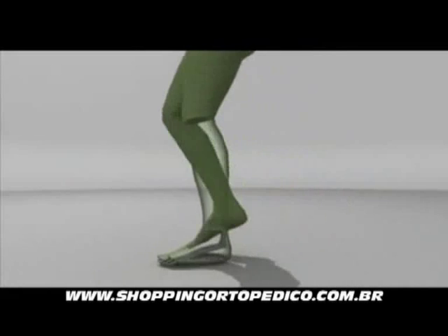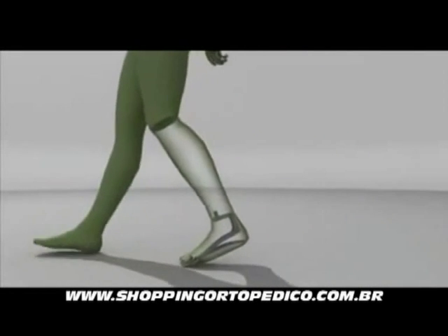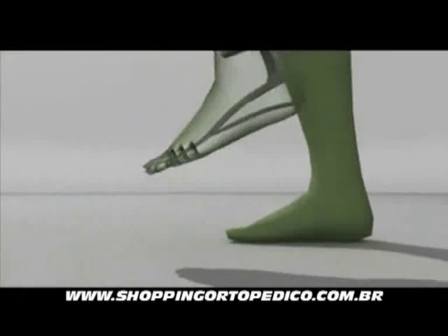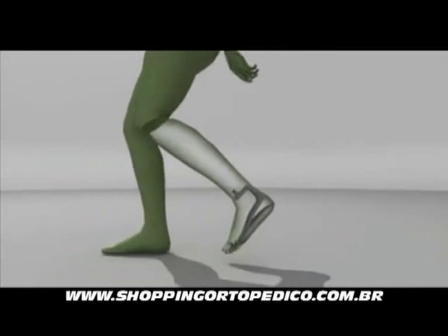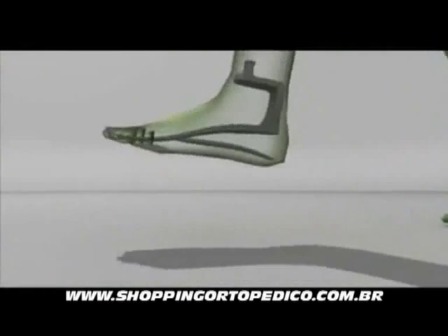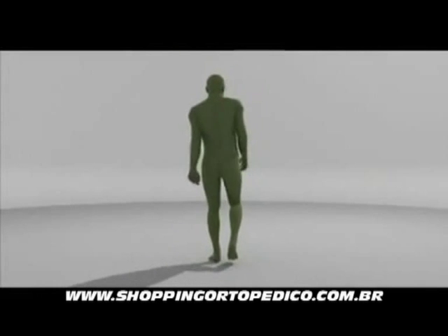In a conventional prosthetic foot, the angle of the ankle remains in a neutral position, with the result that during swing phase the toe effectively drags, unless the prosthesis is raised abnormally to clear the ground. This leads to additional call on remaining muscles and abnormal stress on the skeletal joints, which stress the body unnecessarily.